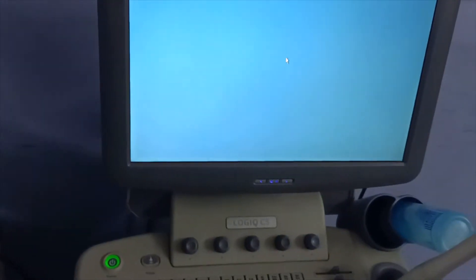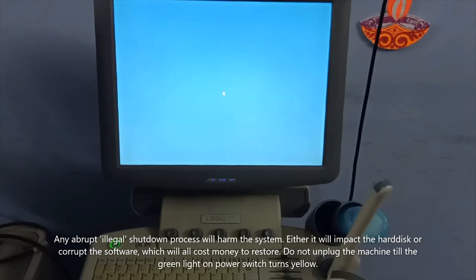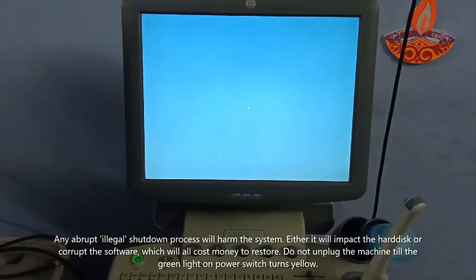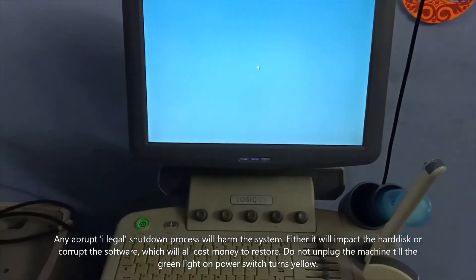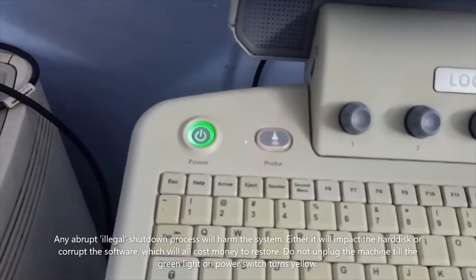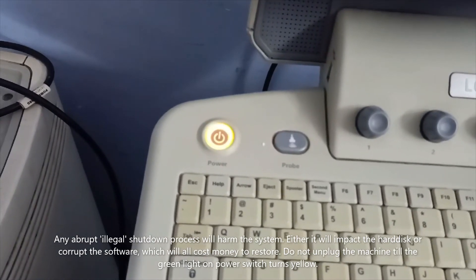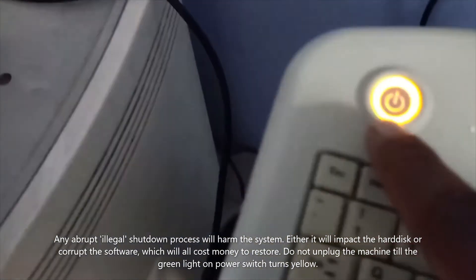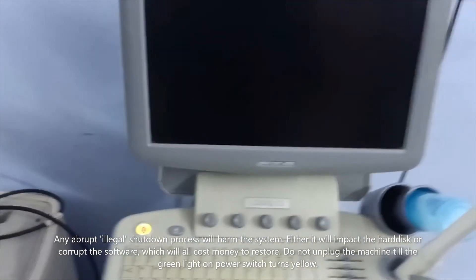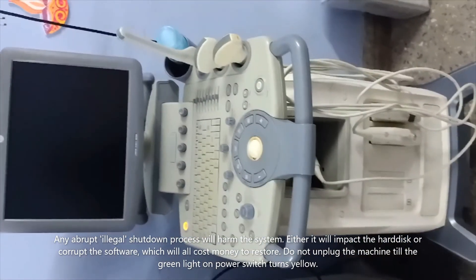Proper shutdown helps extend the machine's life. An illegal or forced shutdown can cause software corruption or hardware damage to the hard disk, requiring costly repairs. After clicking shutdown, do not unplug the power until the green power indicator light turns off and the yellow light comes on — wait until that point before removing the plug from the socket.